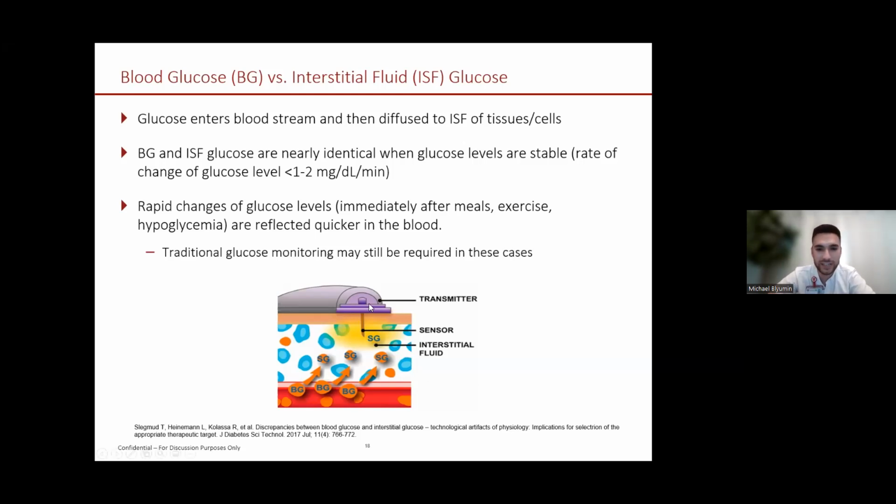And this is, as you can see, the device. It sits, the sensor, this is the sensor specifically. It has an adhesive layer that sticks on your skin, and then the small sensor that goes into the interstitial fluid. Depending on what system you get, sometimes they are rigid, but on the more common systems, they're almost like a hairbrush type material. This might look painful in the way it's sitting, but I've put them on myself. It's very painless. You don't really feel it.